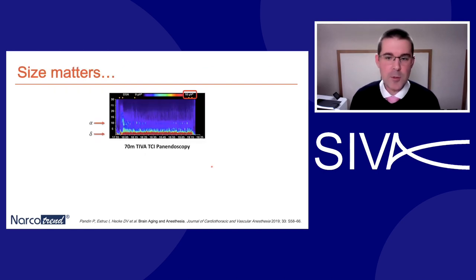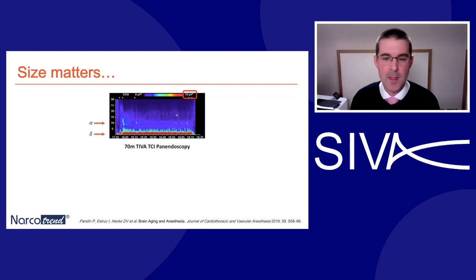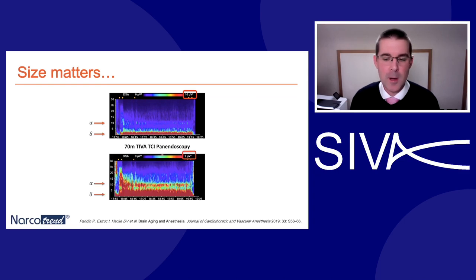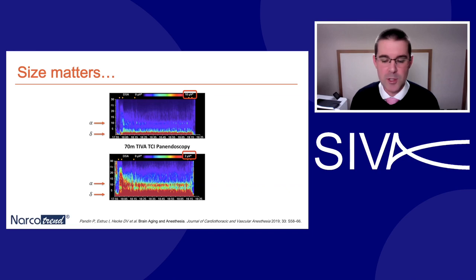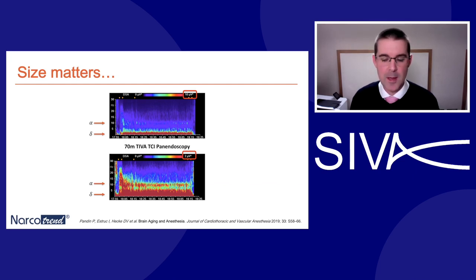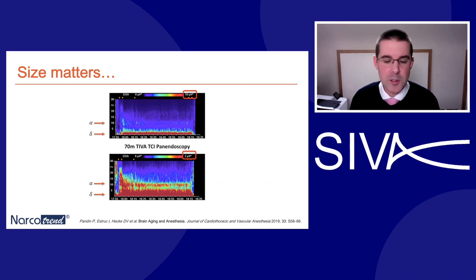It's useful to be able to adjust the scale of the monitor so you can see those alpha oscillations in older or frailer patients, as they usually have lower power and therefore appear smaller. In this 70-year-old male we can hardly see those alpha oscillations at all, but by adjusting the scale on the Narcotrend's spectrogram we can clearly see those lower power alpha oscillations that the older brain is producing — rather like turning up the volume. The DSA and EEG should always be interpreted in the context of the patient's age and the scale of the graph.